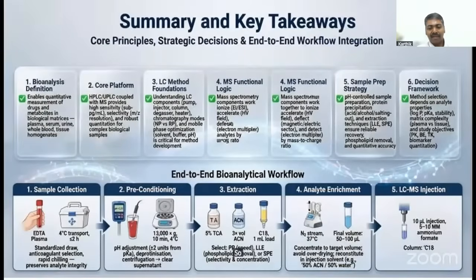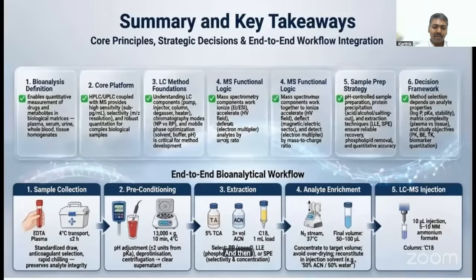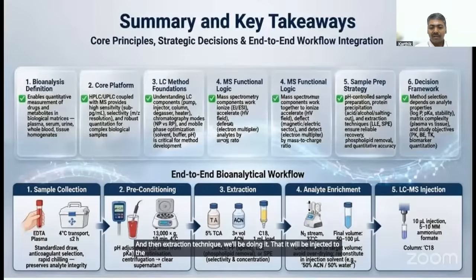So this is the key takeaway from these extraction techniques, and how we do the end-to-end bioanalytical workflow. The sample collection will be done, and then it has to be preconditioned with pH adjustment in the plasma or the matrix we are using, and then the extraction technique will be done. After that it will be injected into the analytical instrumentation, and there we get the final output. So this is the end-to-end workflow integration for the bioanalytical workflow.